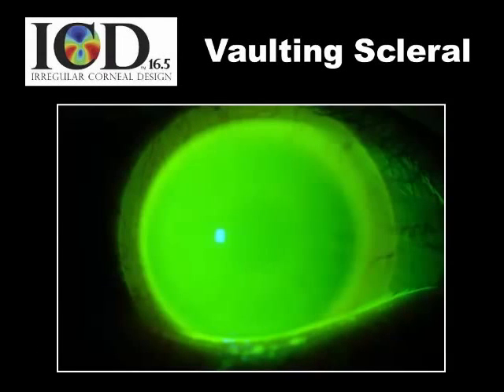The ICD lens is a vaulted scleral lens, meaning that it vaults the entire cornea and ideally should vault the limbus before it finally lands down on the sclera. It's not a corneal scleral lens that would share its bearing between the cornea and the sclera.